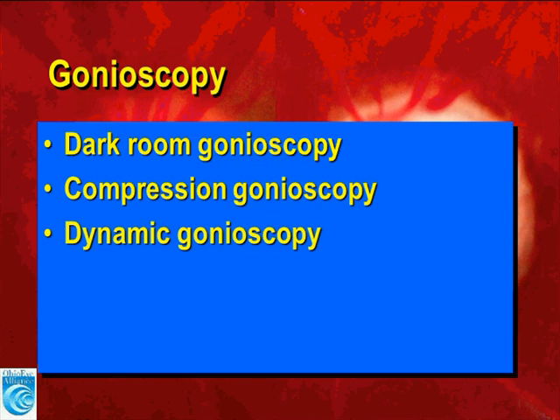Darkroom gonioscopy, compression gonioscopy, and dynamic gonioscopy are very useful techniques, especially when evaluating an angle that is more on the narrow side or where we are concerned about the possibility of adhesions or peripheral anterior synechia.